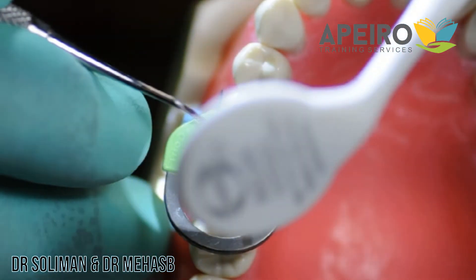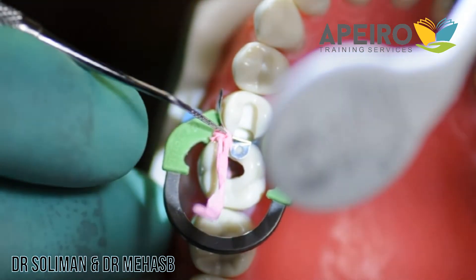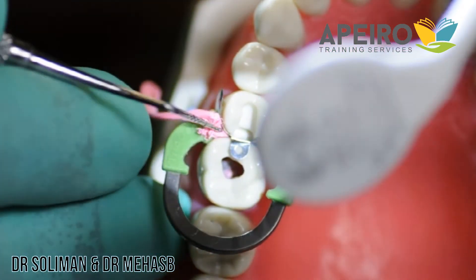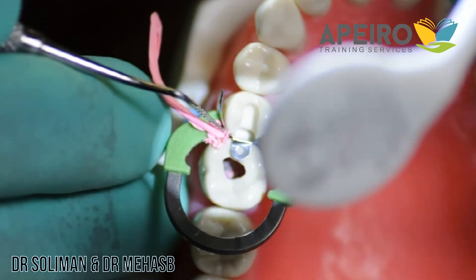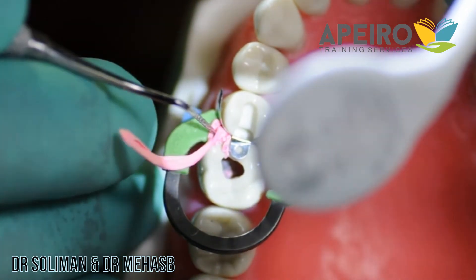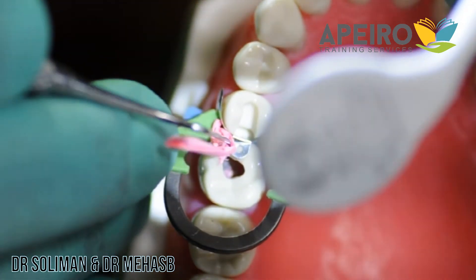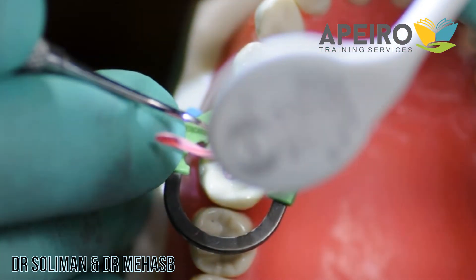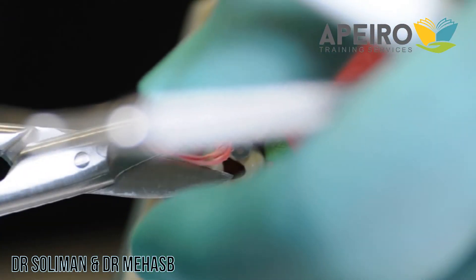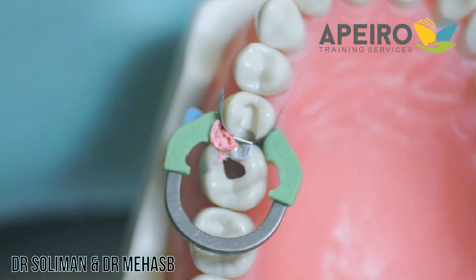With a perio probe or a flat plastic instrument, push the Teflon tape to push the band toward the tooth to avoid getting any excess material there. This will help during finishing so you won't spend much time on the finishing part. If there is excess, cut it, and you can do the same on the other side.